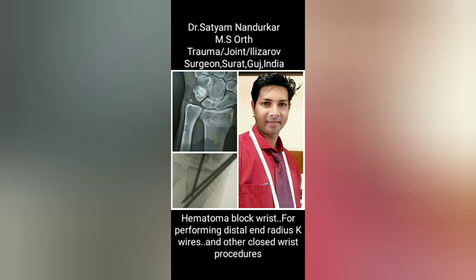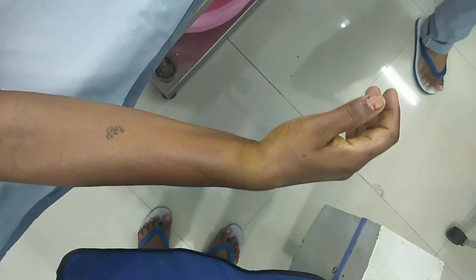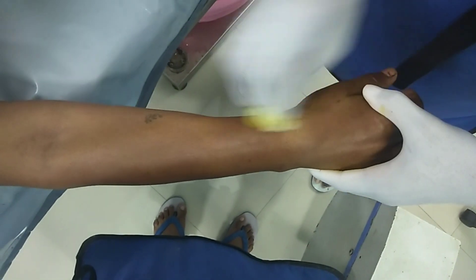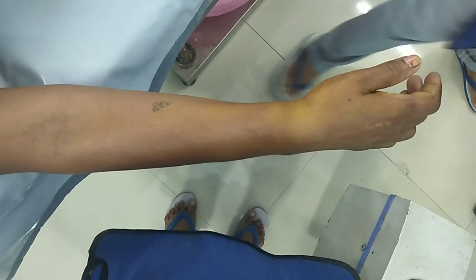Today I will be showing you a fresh case of Colles' fracture. You can see the patient is having a fractured Colles' distal radius, almost 2 hours post-trauma. We are prepared for giving a hematoma block over the wrist joint.